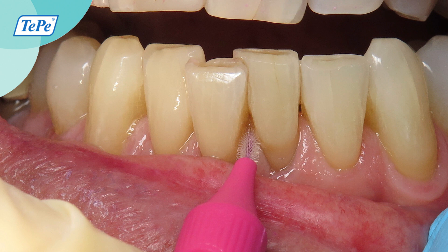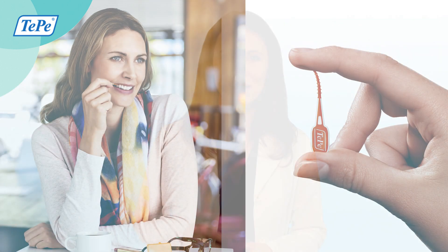There's no doubt the Tepe interdental brushes make cleaning between your teeth so much easier, but there's an amazing complement to the interdental brushes with nylon bristles, and that is the Tepe Easy Pick.